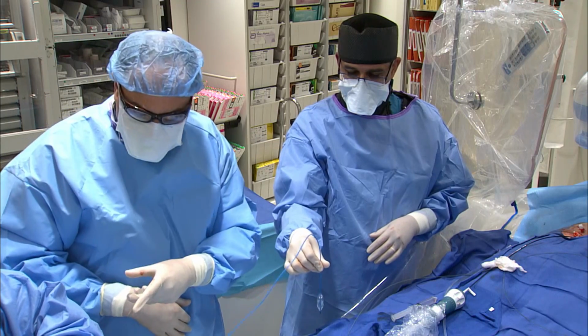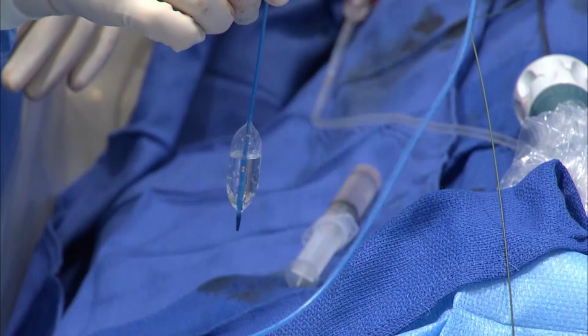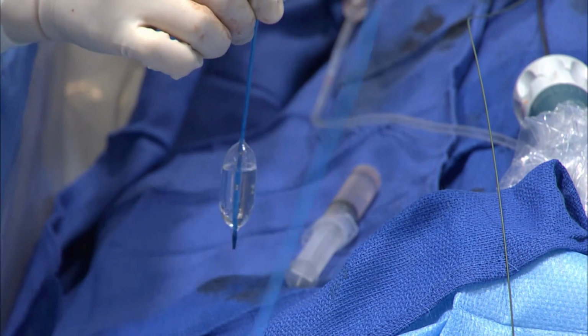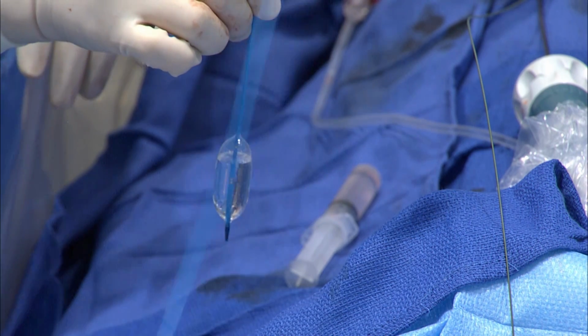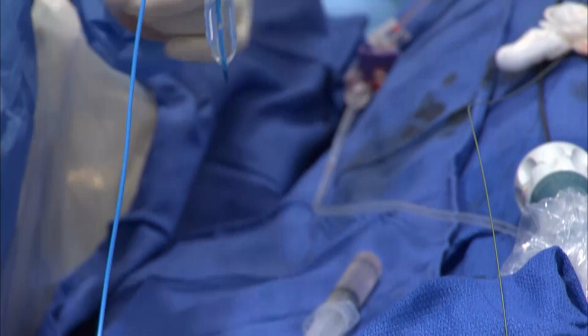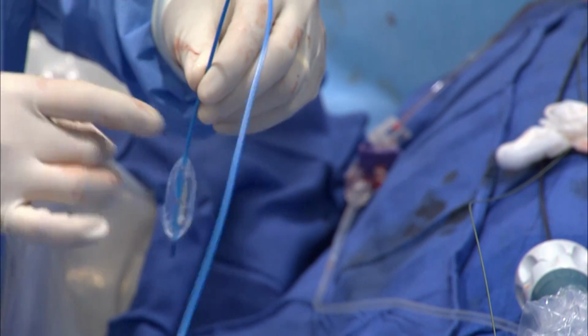So the solution that we use is 1:4 dilution. So it's 1 time contrast and 4 times water. We're just trying to de-air the balloon.